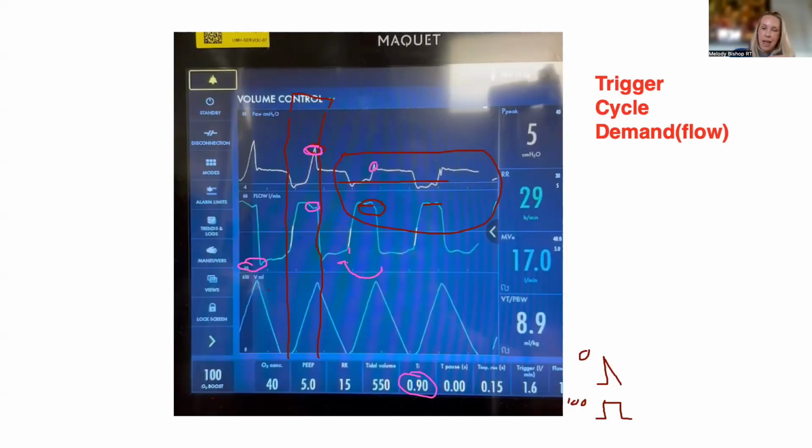Because again, I do see missed triggers and a delayed trigger in this. I see a deflection negative in the pressure at the same time we're having a positive in the expiratory. I think this patient, if you watch their chest, would be breathing rapidly at a rate of 40, in, out, and actively inspiring and expiring.